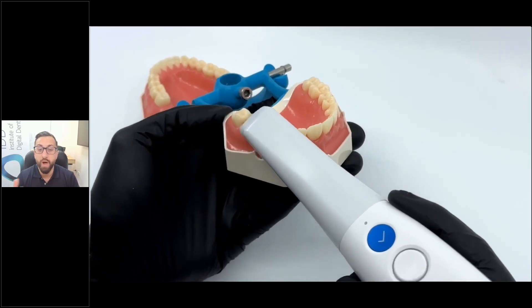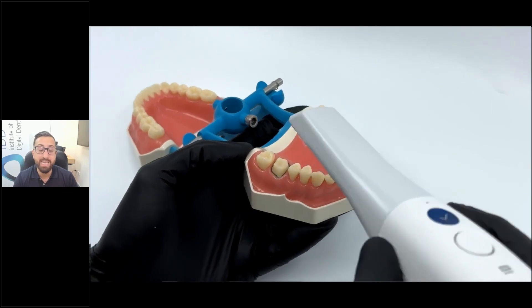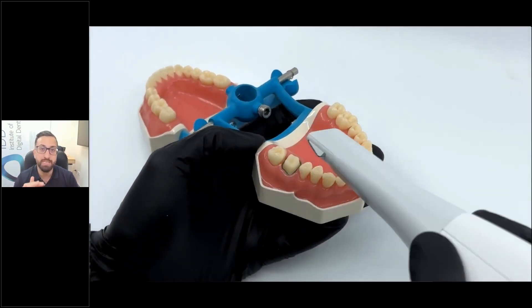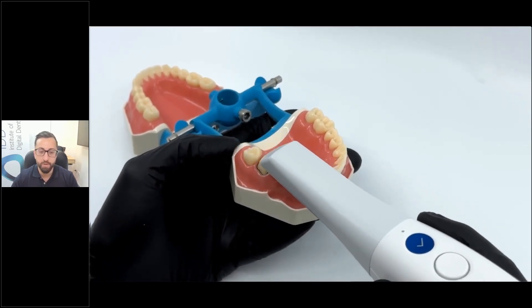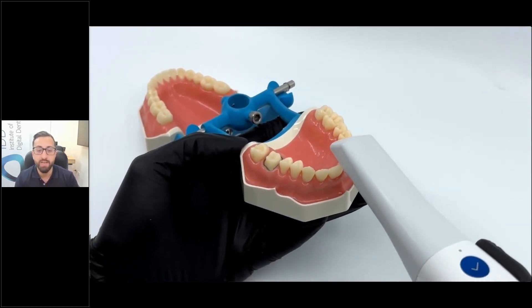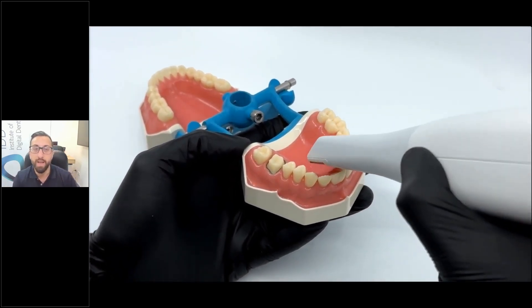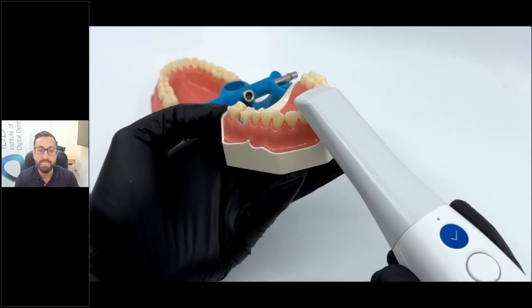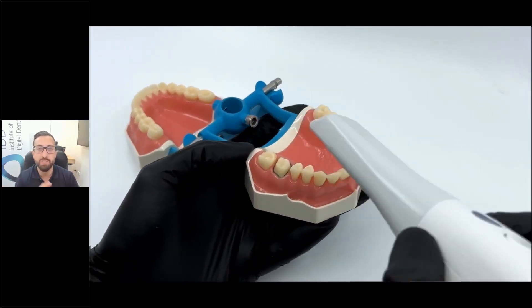One key thing you can see here is how I get the contact points — you can come quite buccal and rotate the scanner to get the contact points, and you can also approach the contact points from the palatal. You start on the occlusal, go all the way to the other side, make sure you capture the incisal edges, rotate, capture all the palatal surfaces, rotate, capture all the buccal surfaces. You want to practice this as much as possible so that you can do this in one pass — you don't want to start and stop too much.